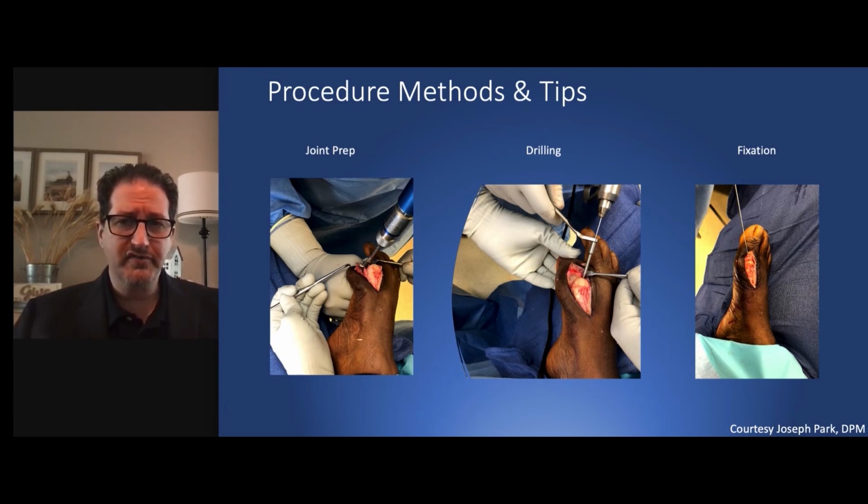I tend to fix my hallux with the nail facing up. With the hallux in a rectus position, I tend not to transversely make the digit parallel to the second, especially in patients who have hallux valgus. So hallux valgus patients, I will actually try to make that digit as rectus as I can in line with the metatarsal so that I can close the intermetatarsal angle. If I leave it abducted, then you're going to have a failure.